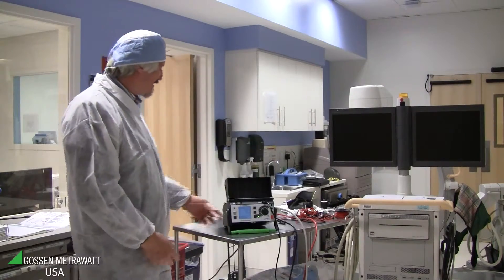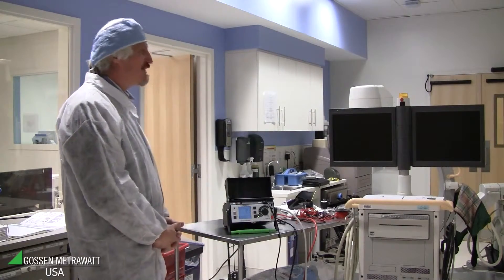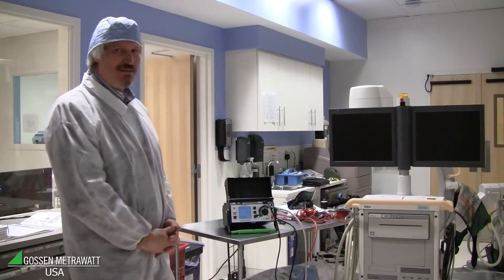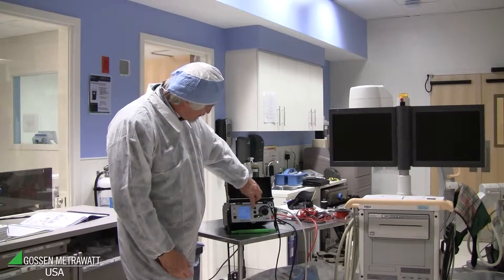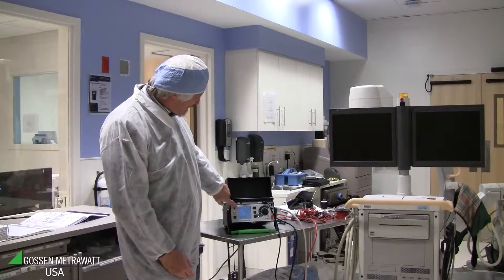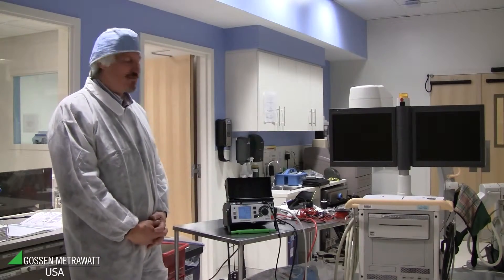We would like to look at the single fault condition — what happens if the ground wire is broken. That can be a danger for the patient, so we check the single fault condition where PE is interrupted. With this tester it's very easy: just push the button for single fault condition, and you see the leakage current with PE interrupted. In this example it's 63 microamps.